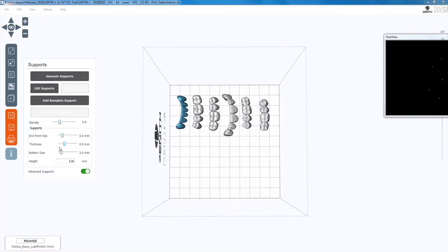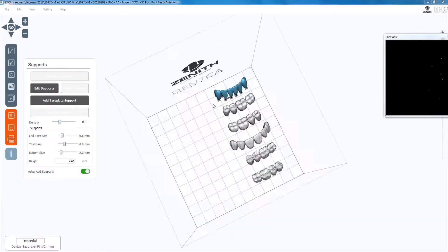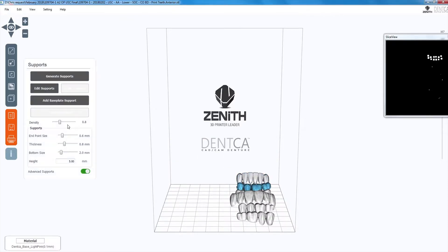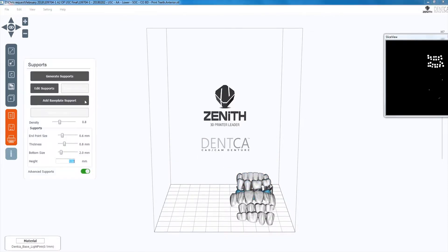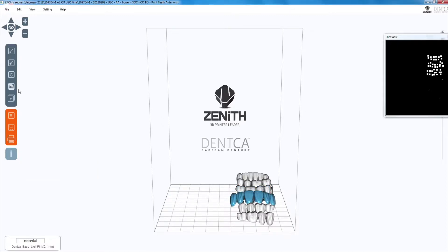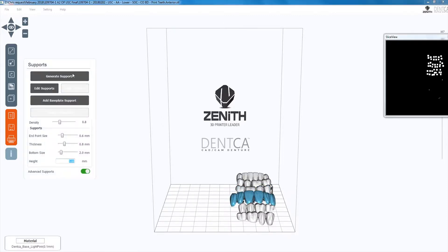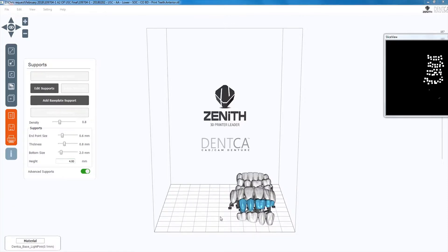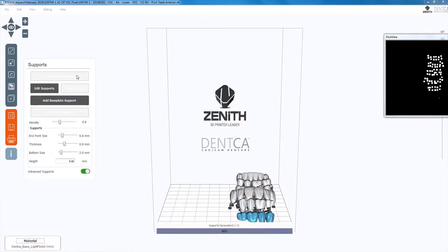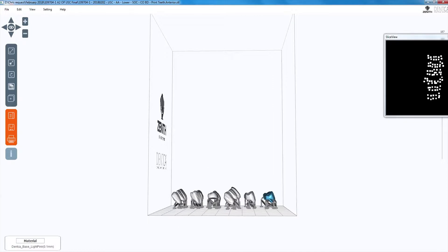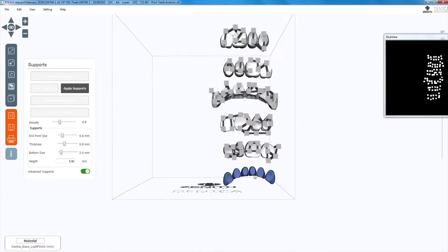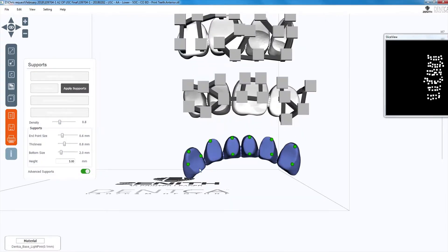Once finished, generate the supports and edit them so the lower anterior incisal teeth have one support on the lingual and one on the facial. Canines should have additional support on the distal section. Once finished, apply supports and generate the base as established in the previous part of the tutorial.